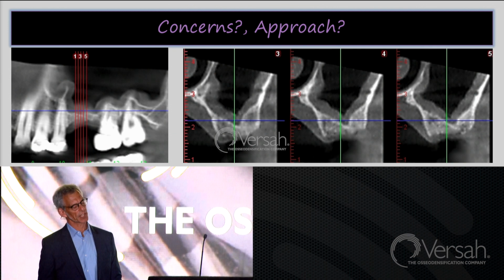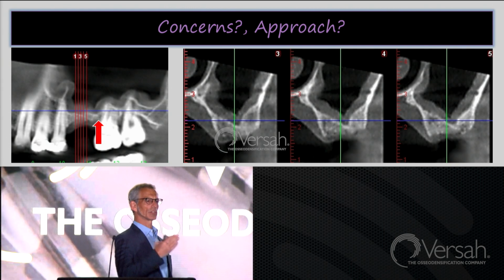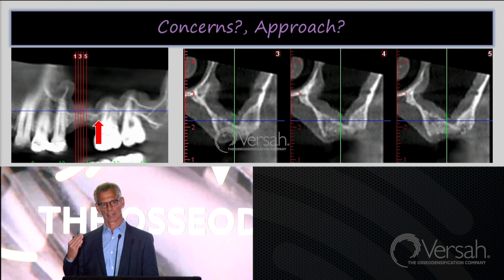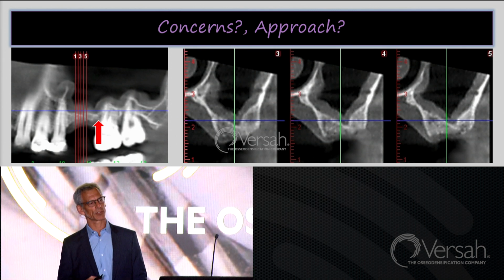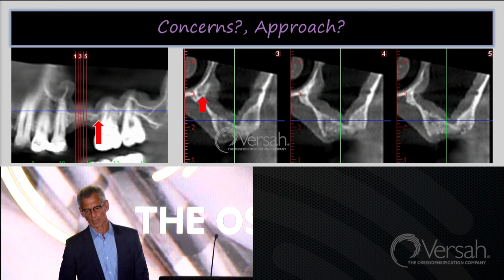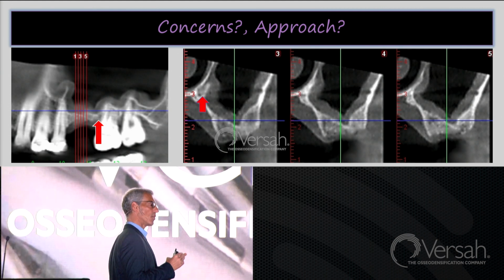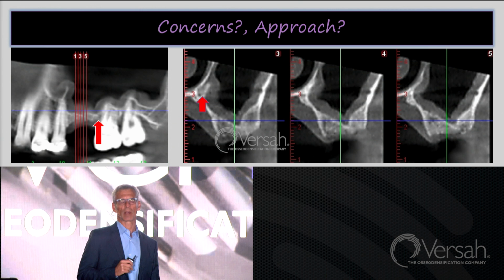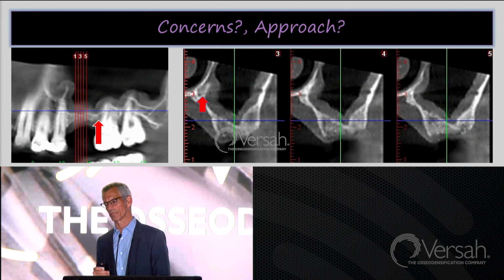Okay, remember I said he's got periodontal disease. It's been fairly well controlled, inflammatory process decreased, but he's got vertical defects on these molars. I don't want my implant anywhere near that vertical defect on tooth number 15. There's a sinus septum on the medial wall. If I do a lateral window, how easy is it to elevate a membrane off of that septum? Is that a great risk for perforation?